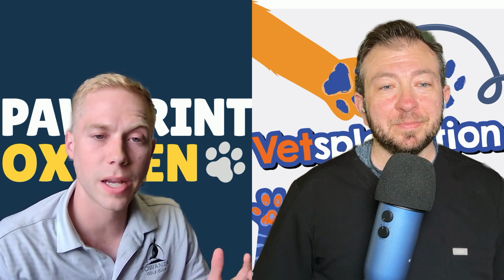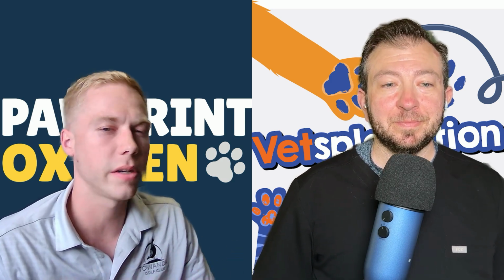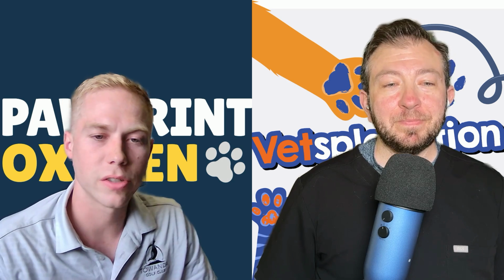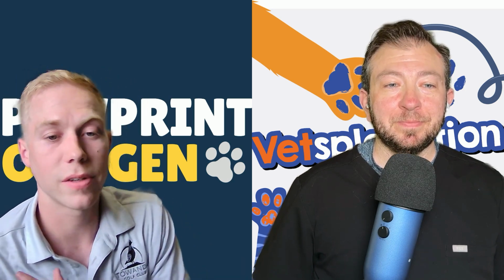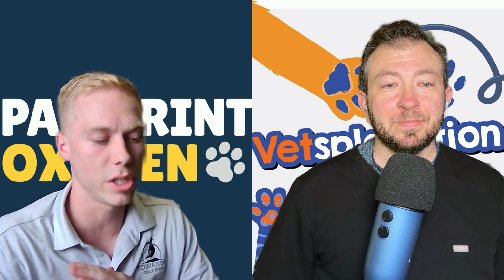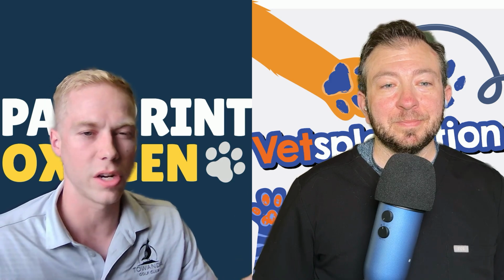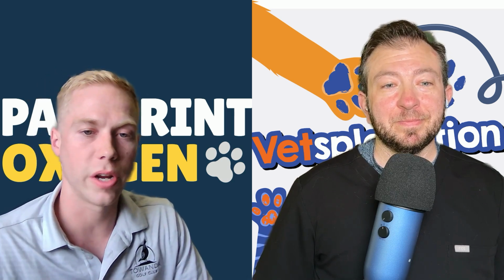So, some other use cases for that is sometimes we'll get a dog with pneumonia that is doing well at the hospital, and they don't necessarily need the 24/7 attention vet care, but they do need, let's say, 40% oxygen for the next 2 weeks or so. And that can get really difficult as a burden both on the hospital and for the pet owner, because that's very expensive. So for certain conditions where you don't need the 24/7 care, but you really just need longer term oxygen, we will actually sell and or rent an oxygen chamber, which kind of looks like a crate for a dog, but it's meant to set at a certain oxygen level, just like you would in the clinic.